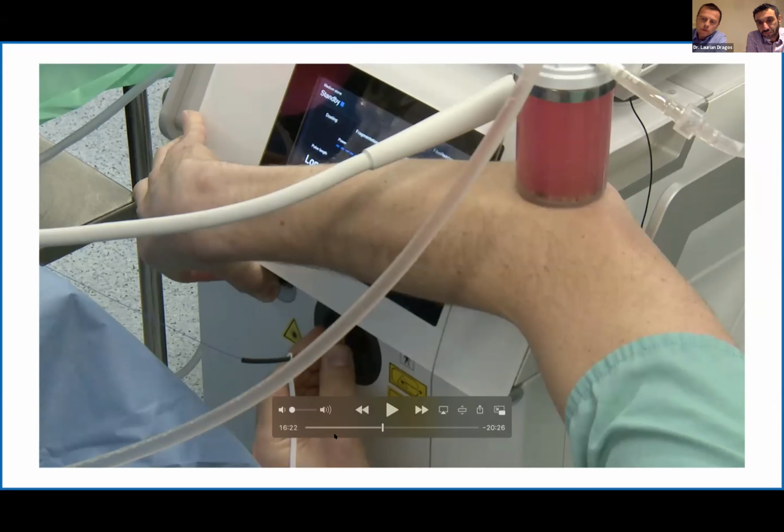Yeah, I think it's a natural tendency to miniaturize if you get more or less similar results. And this is something that we are definitely going to see in the future: we will have smaller flexible ureteroscopes, and mini PCNL or a mini combined approach is already quite often used now all over Europe. So yeah.